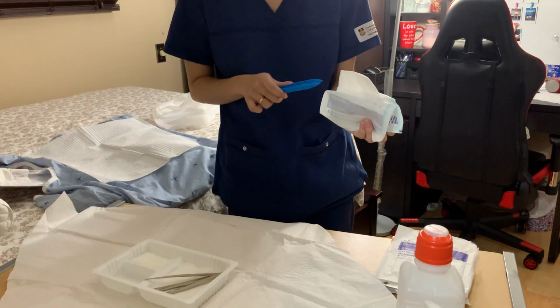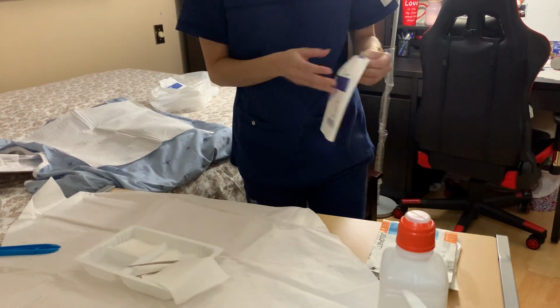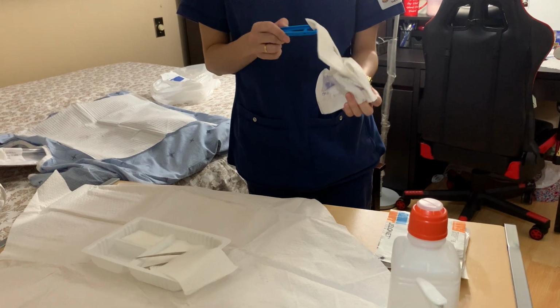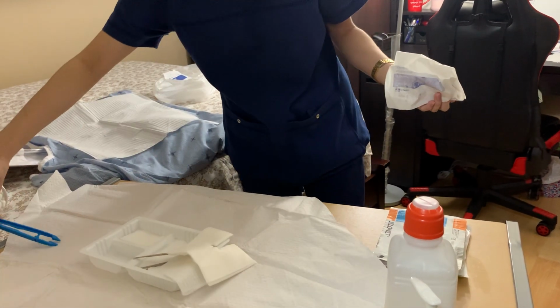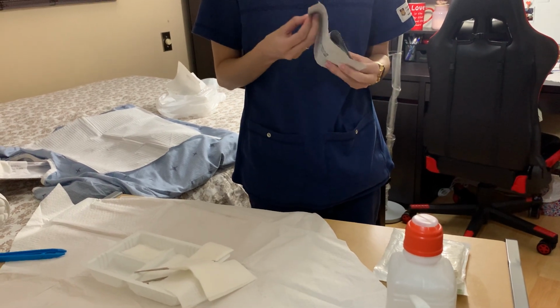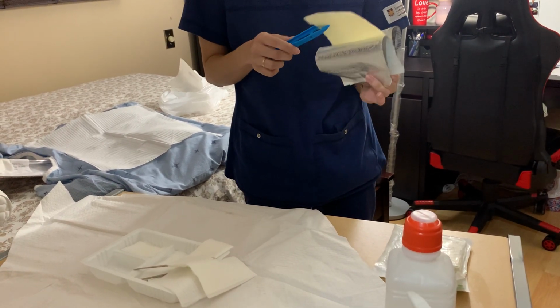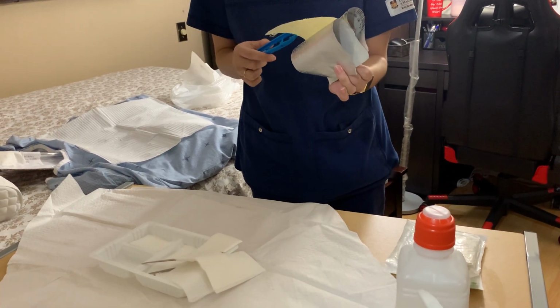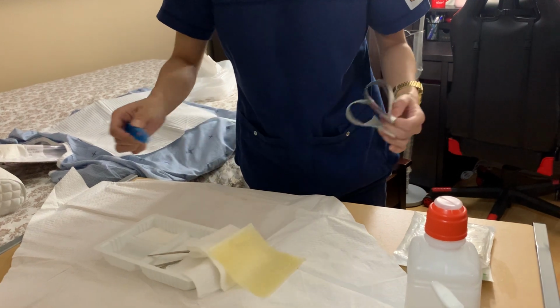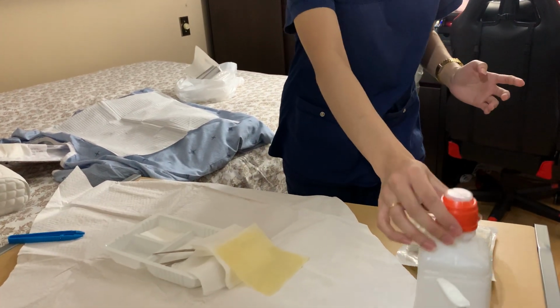Okay, so I'm just going to make sure that it doesn't flip back. This is just garbage. I have my drain sponge here. Again, making sure that it doesn't flip back. Garbage as well. I also have my Jelonet. Okay, this is just garbage. And now I'm going to add my normal saline.